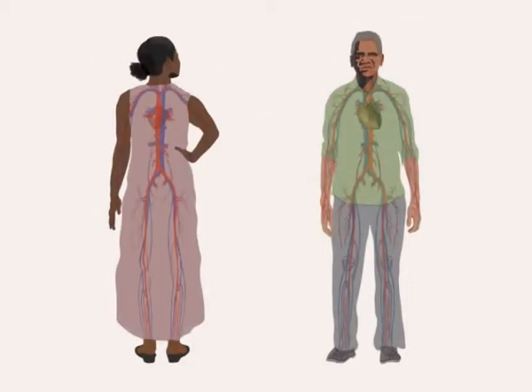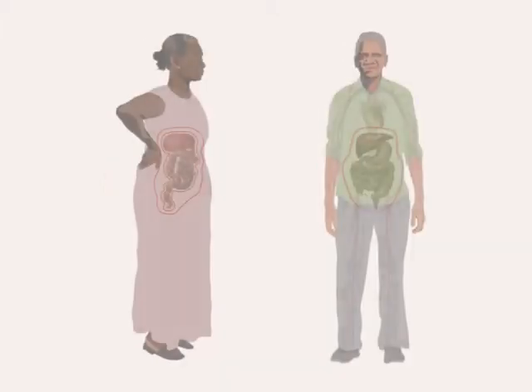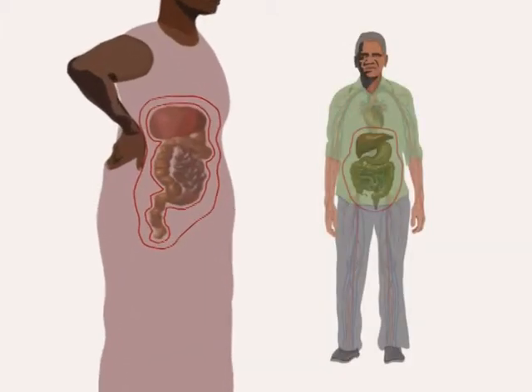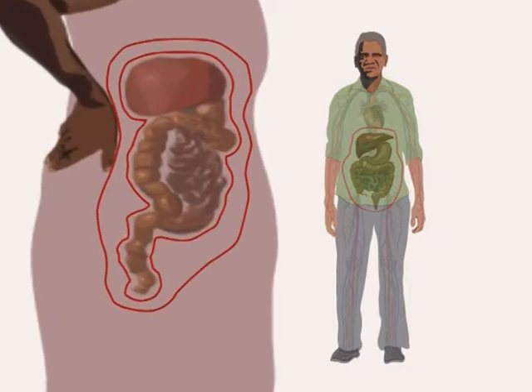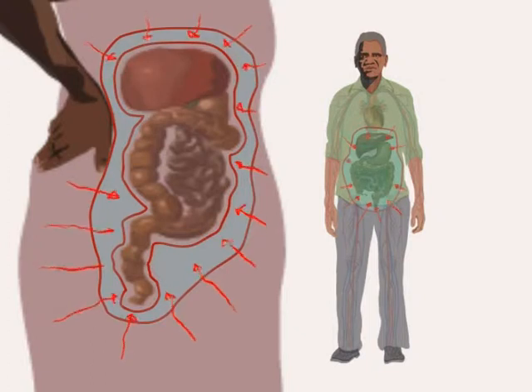The word dialysis is about cleaning your blood. When you do PD, you fill up that peritoneum with a kind of water for cleaning called dialysis fluid. When the cleaning water is in your peritoneum, the rubbish in your blood goes into the water.